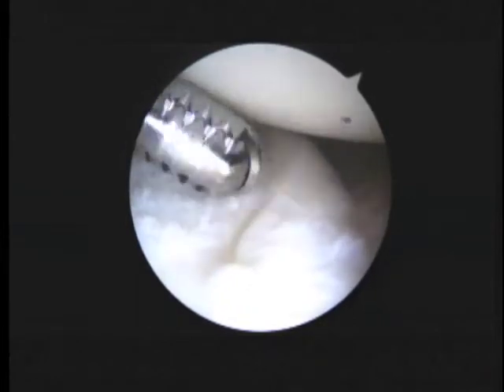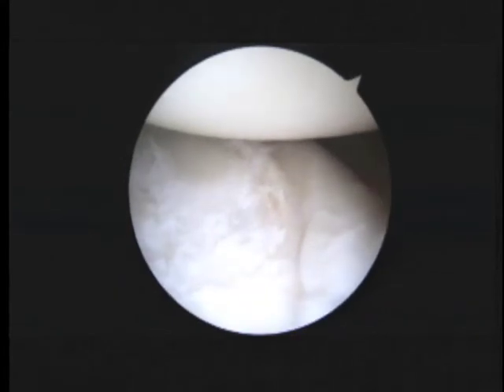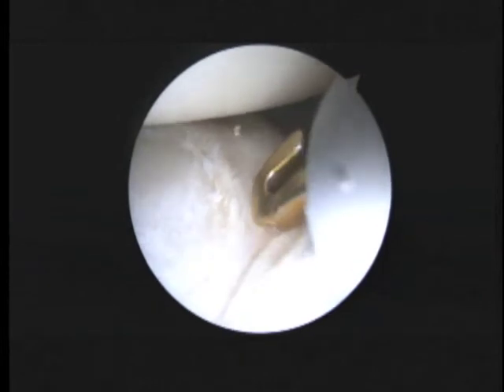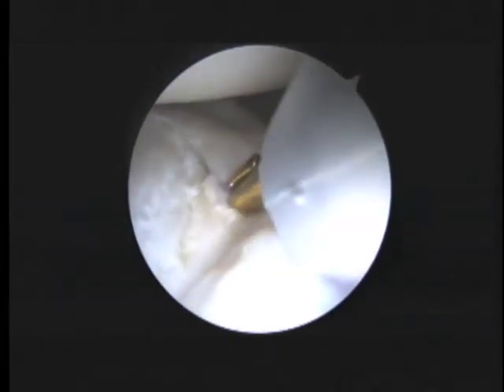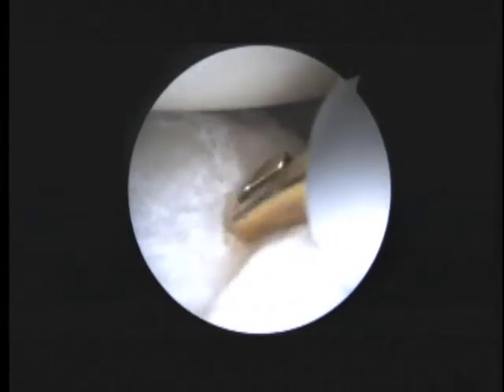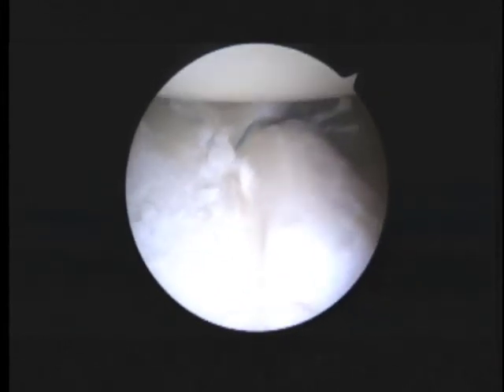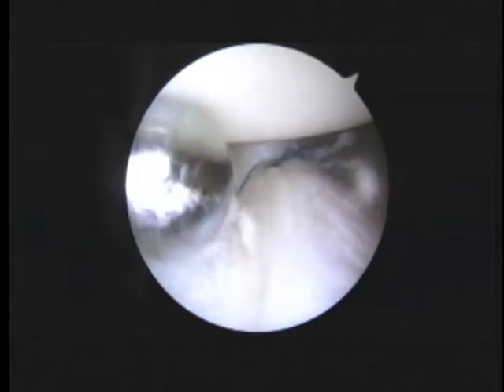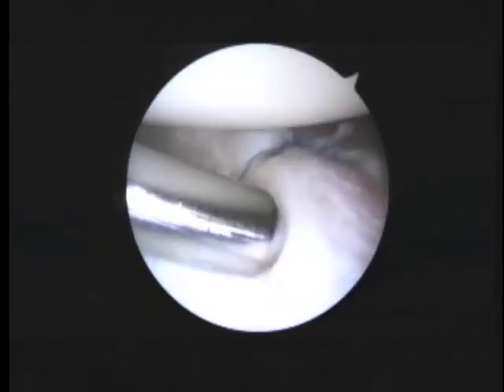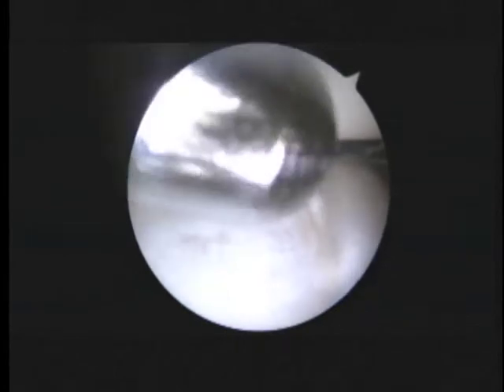You'll notice the labrum on the front doesn't really look detached — let's take a probe and check it. As I put in this probe, you can see it's torn there a little bit. I may put one anchor in, but it's not as bad as the back. Now we've got one anchor placed and tied in the front, and that looks good — that looks stable. I don't think we need another anchor. So we've got two in the back, one in the front, a little bit of arthritis.